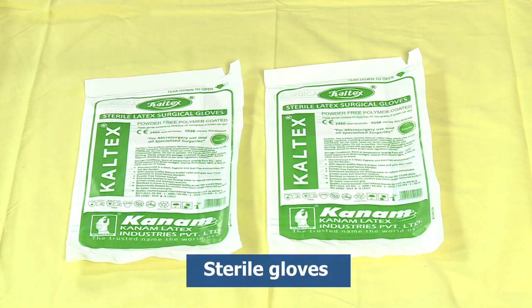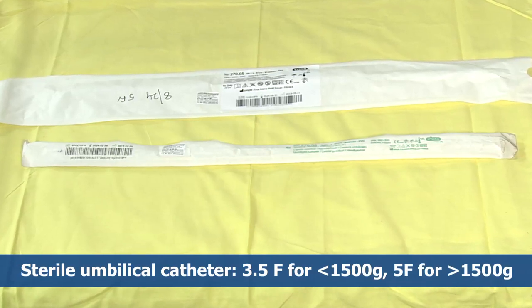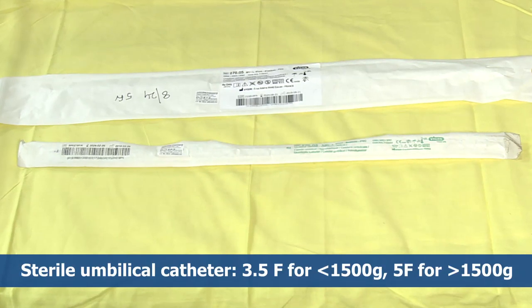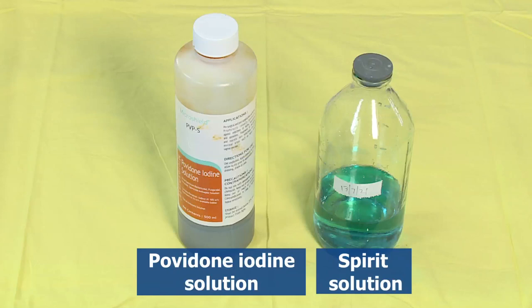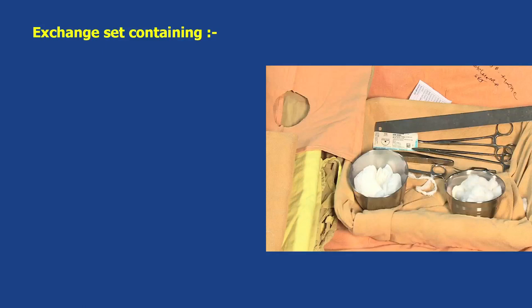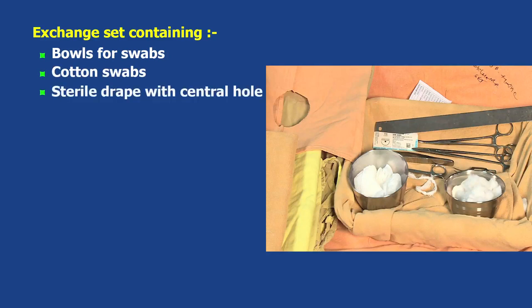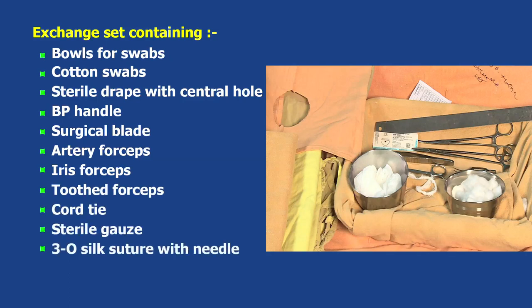Equipment required: a pair of sterile gloves; sterile umbilical catheter of 3.5 French for less than 1500 grams and 5 French for more than 1500 grams; syringes of 5 ml and 10 ml; povidone iodine solution; spirit solution; gown; mask; and an exchange set containing bowls for swabs, cotton swabs, sterile drape with a central hole, BP handle, surgical blade, artery forceps, iris forceps, toothed forceps, cord tie, sterile gauze, 3-O silk suture with needle, needle holder, and a three-way stopcock.